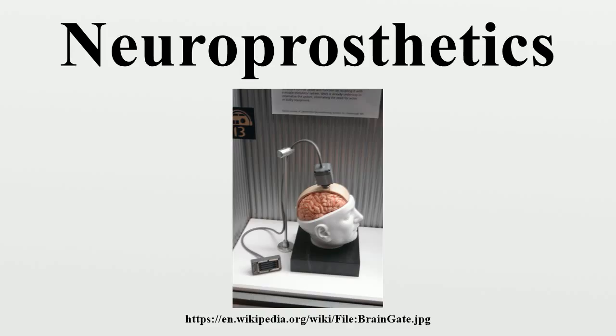The most easily recruited by a dorsal midline electrode, close to the surface of the spinal cord, are the large dorsal column afferents, which produce broad paresthesia covering segments caudally.